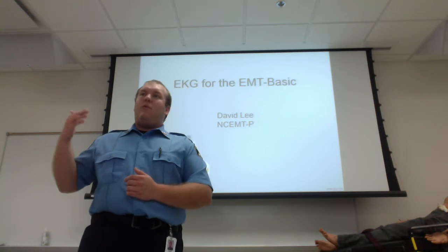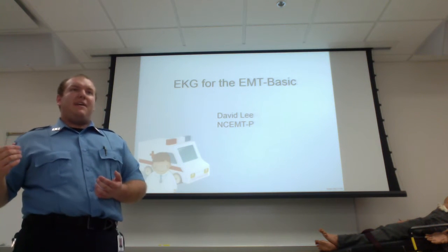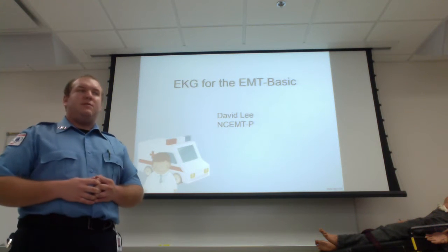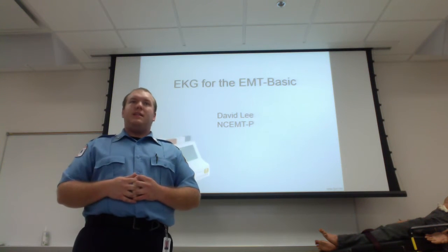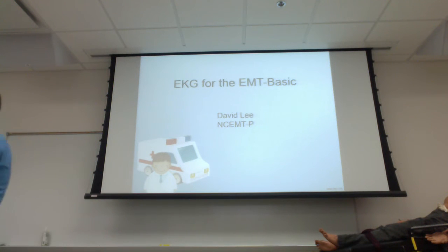Then, the way modern technology is moving, we can transmit it via the radio system or cell phones to the hospital, and the emergency department on the way can know this is going to be a critical patient. We need to get this patient loaded and go.